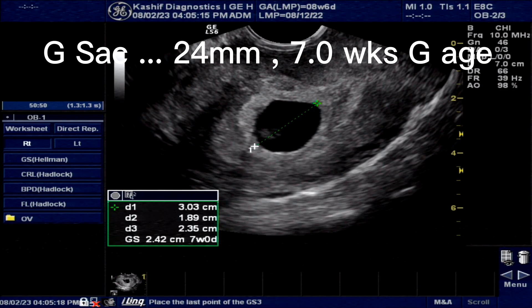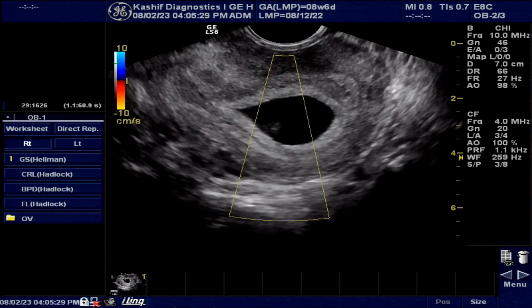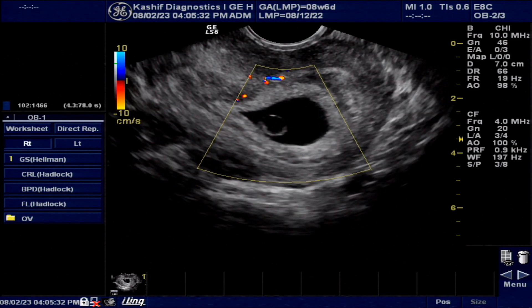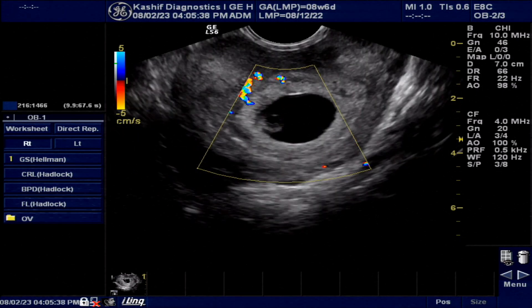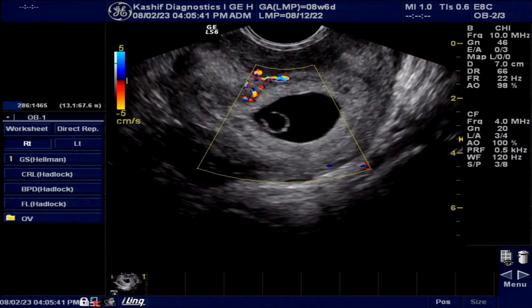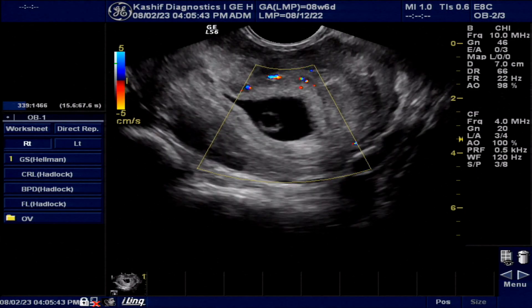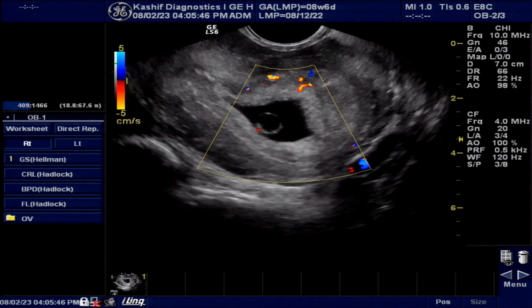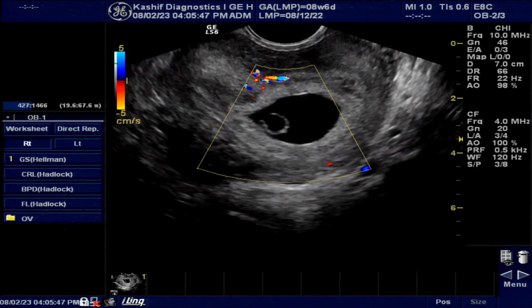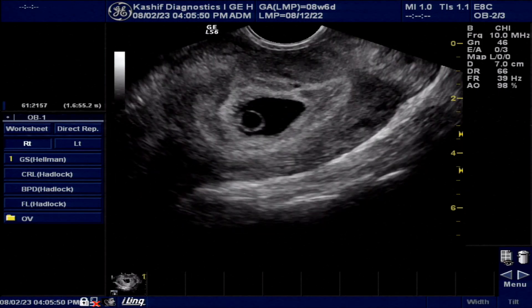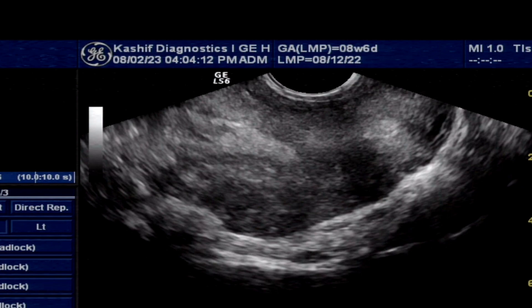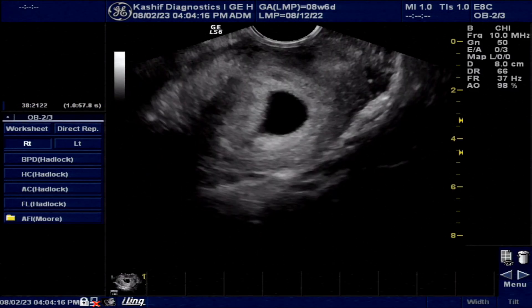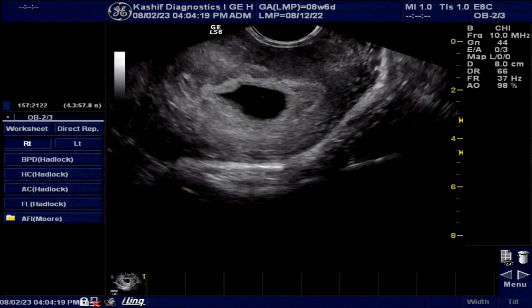No fetal pole is seen. No intrasac blood flow seen. No perisac fluid seen. There is a small fibroid seen on the outer side posteriorly — this is non-complicated and not causing any problem. There are mild irregular margins of the gestational sac.